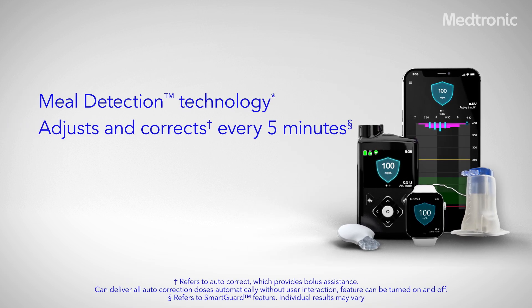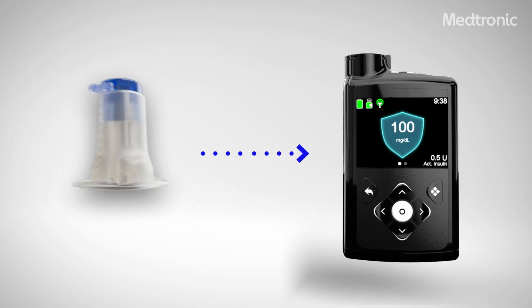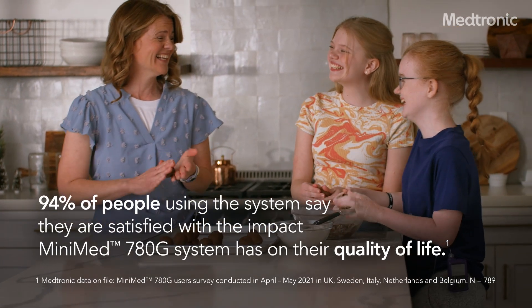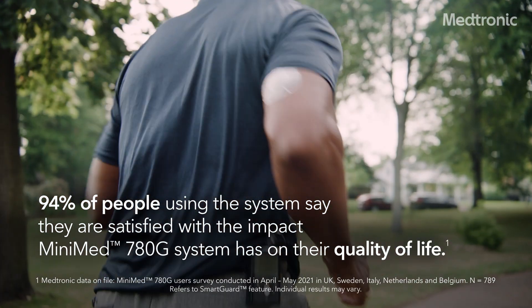It automatically adjusts and corrects sugar levels every five minutes with no finger sticks when using SmartGuard technology. And it's compatible with the only infusion set you can wear up to seven days. Let the advanced technology of the MiniMed 780G system take on more of the work for you, so you can focus less on managing diabetes and more on enjoying life.